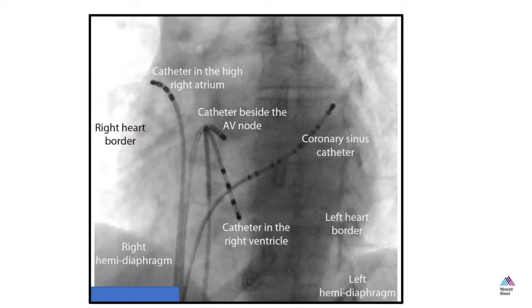Because when we're ablating people with tachycardia, we believe that the best place to put the catheter is on the AV valve because most pathways are smallest or thinnest at that location. In other words, it's easiest to ablate along the AV valve rather than in the atrium or ventricle. Similarly, we think it's less injurious to the heart to burn on the fibrous ring of the annulus rather than directly in the myocardium. So here's our coronary sinus catheter.